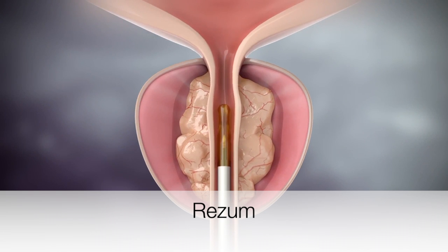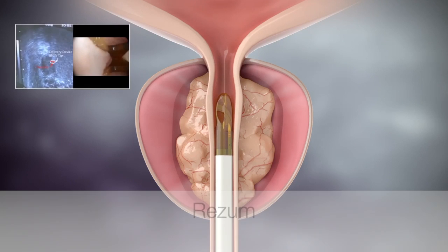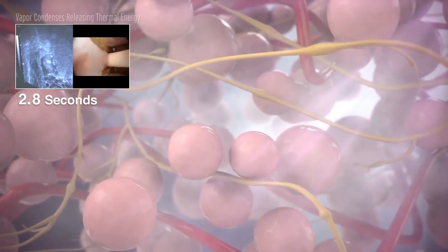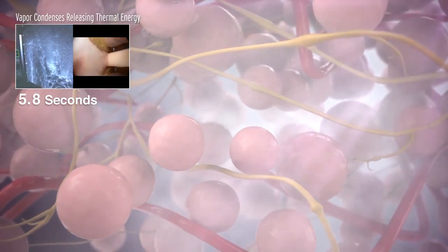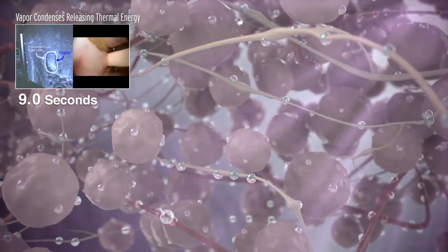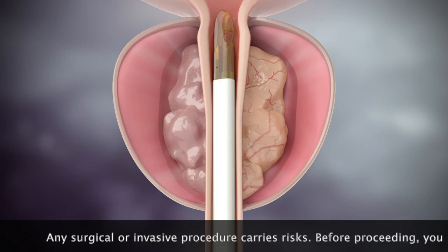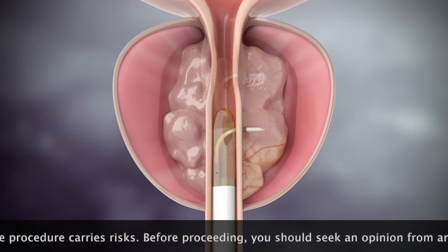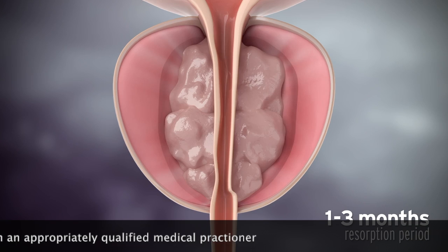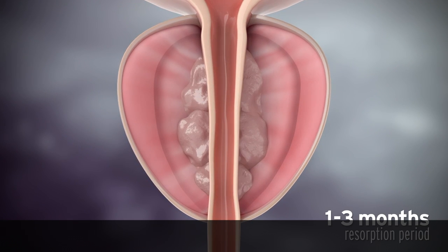The final operation for this video is the Rezum procedure. This is a new technique with five-year follow-up data. We use a telescope that deploys a small needle into the central portion of the prostate. Water vapour at 103 degrees is used to kill tissue in this area in a controlled manner. The steam causes necrosis of the tissue and the number of treatments depends on the length of the prostate. Each treatment takes nine seconds. It takes one to three months for the prostate tissue to shrink away from the urethra, thereby opening up the channel.